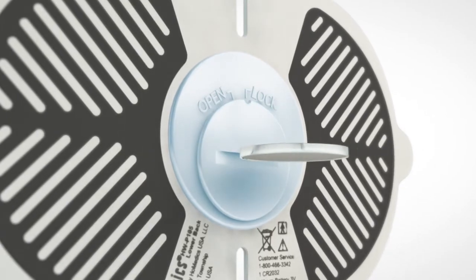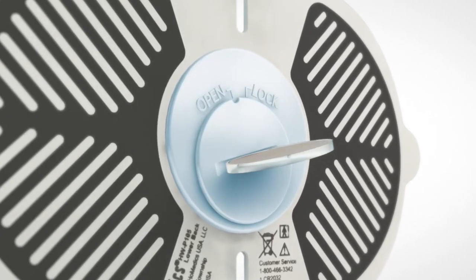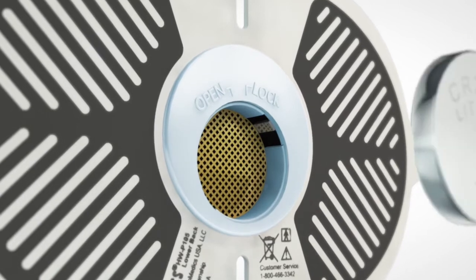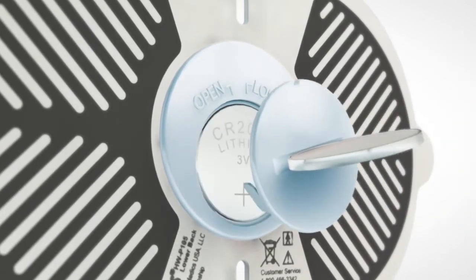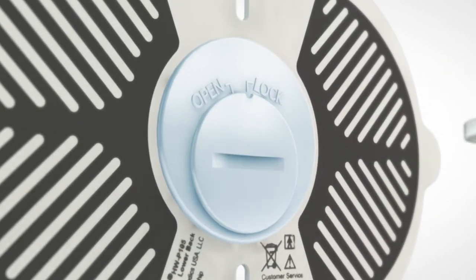Use a coin or flat-headed object to turn the battery cover to the open position. Remove the cover and insert the battery provided. Replace the cover and turn it back to the lock position.